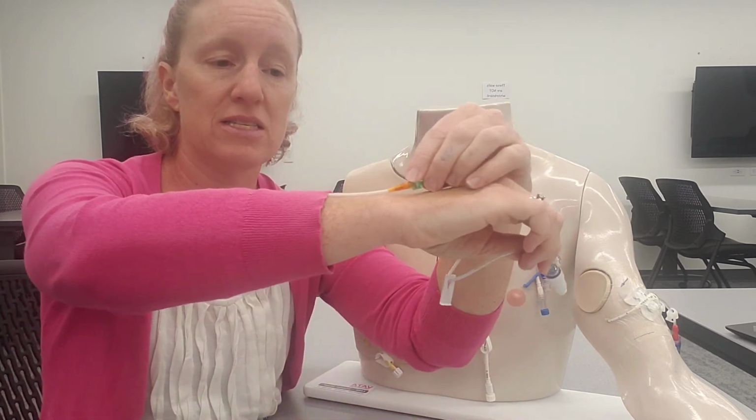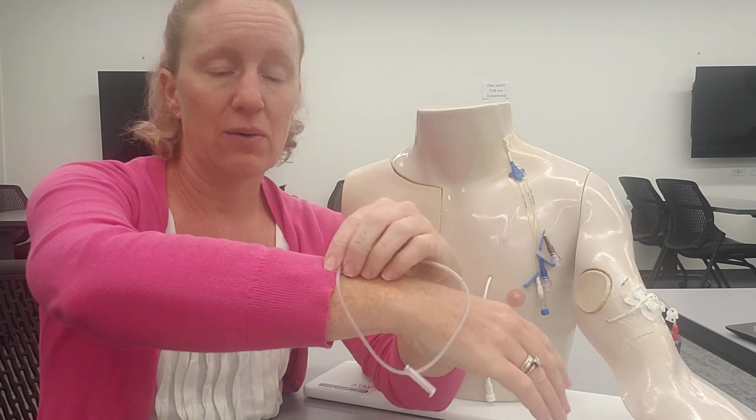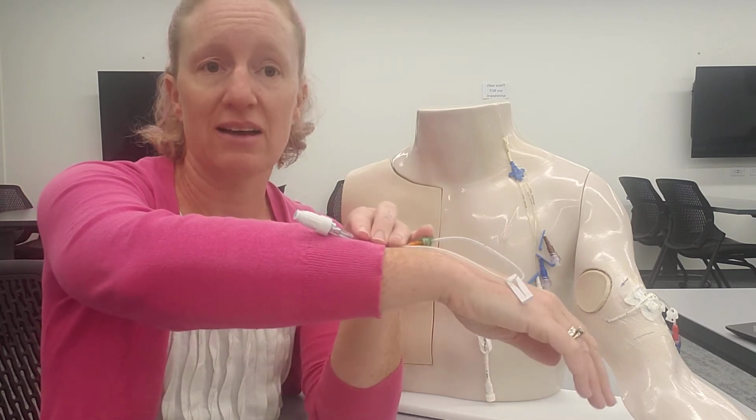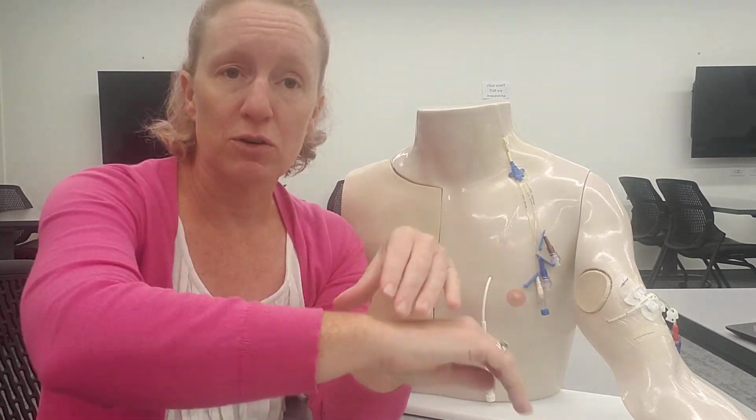When we have it in someone and it's in them, and then we can saline lock it, now I can access or de-access that if they go for a walk or if their antibiotics are done. It allows them more freedom and keeps the IV going longer.